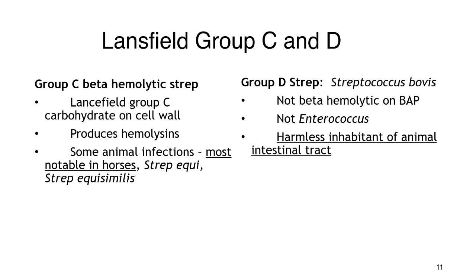You are not going to see all of these in your hands-on labs. Most of the time, any streps that we have, we may not get down to a species name. And again, it will say it is a probable or potential or suggestive of strep.